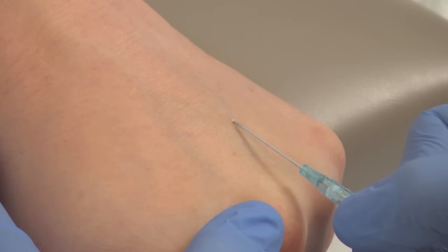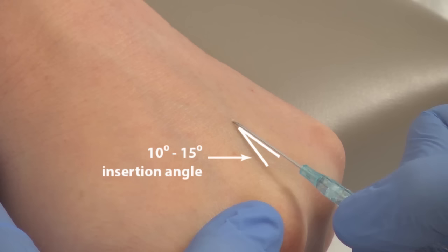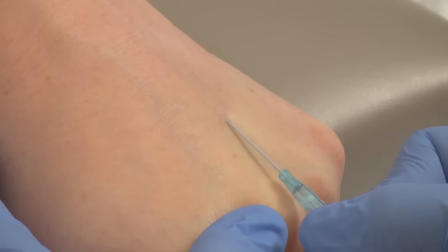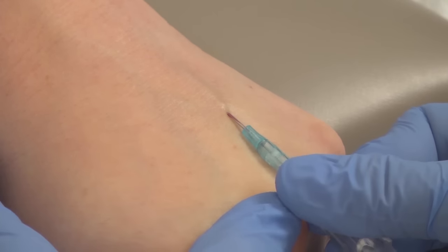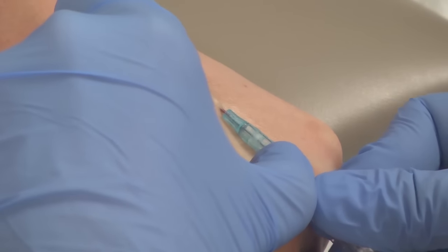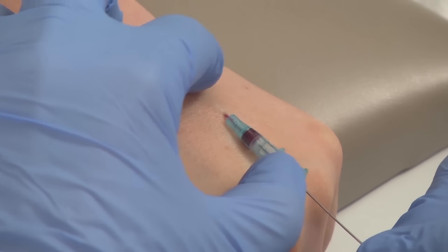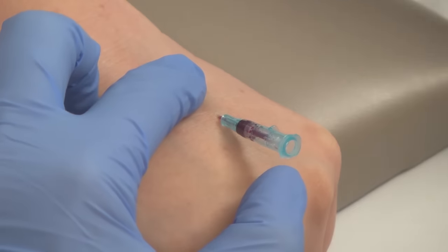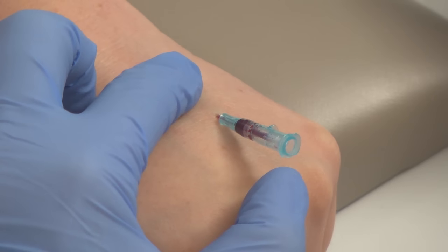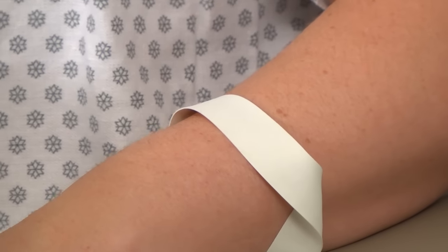Have the angiocath bevel up at a 10 to 15 degree angle as you insert the needle into the skin. As you advance the needle, you will see a blood flashback to confirm you are in the vein. Separate the angiocath and the needle. Apply pressure at the insertion site to minimize bleeding and release the tourniquet using a one-hand quick release.